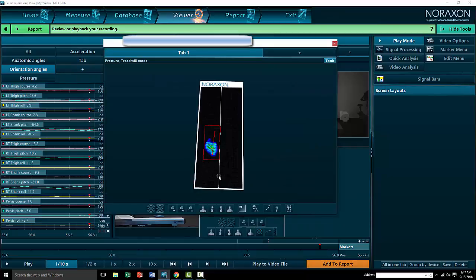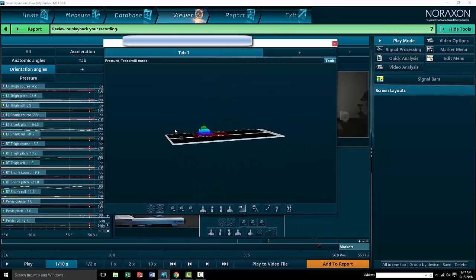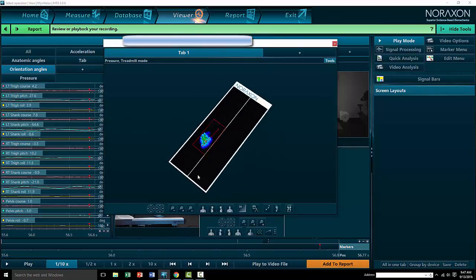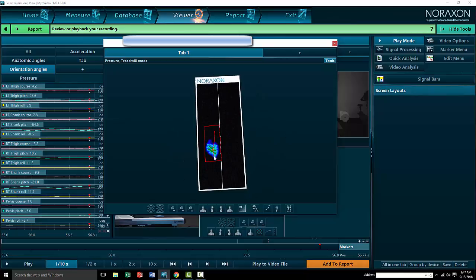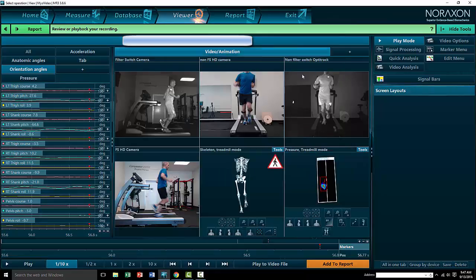With our pressure analysis, we're able to see a 3D graphical representation of landing pressure of the foot: where you land, how hard you land, what part of the foot you're landing with. That allows us to take a look at things like plantar fasciitis or problems with bunion or heel spur pain, Achilles tendonitis. This gives us great data on landing path measurements and pressure analysis.